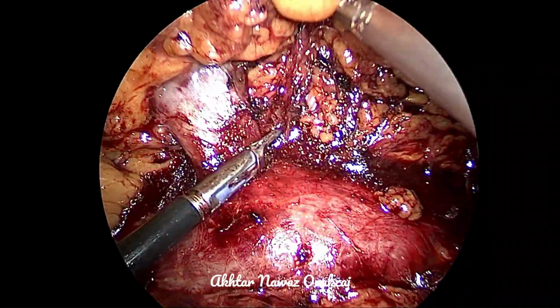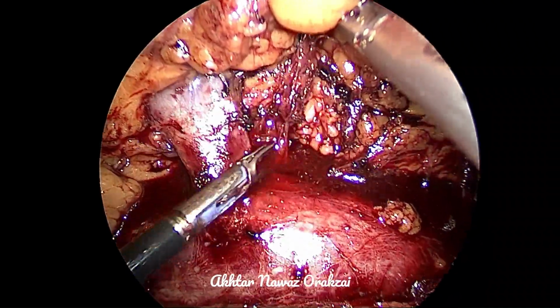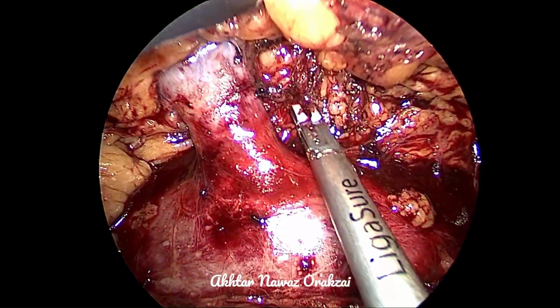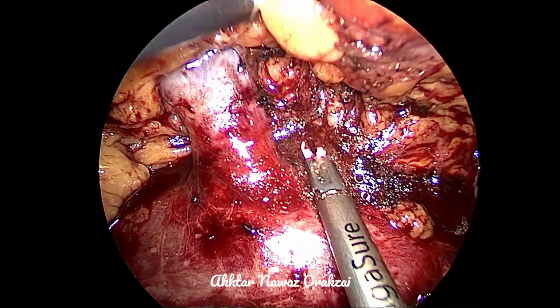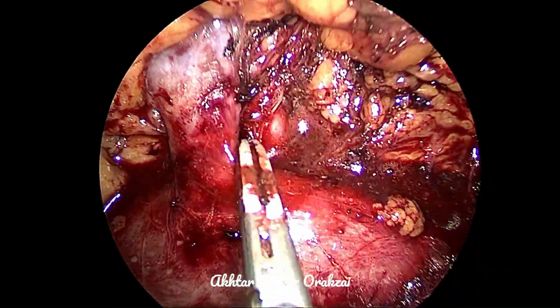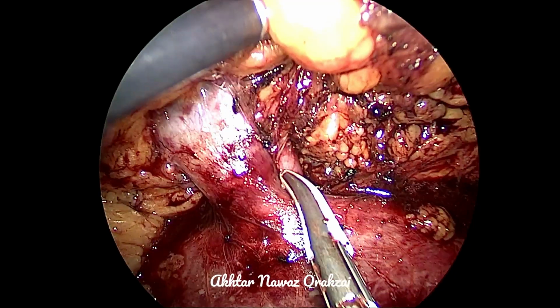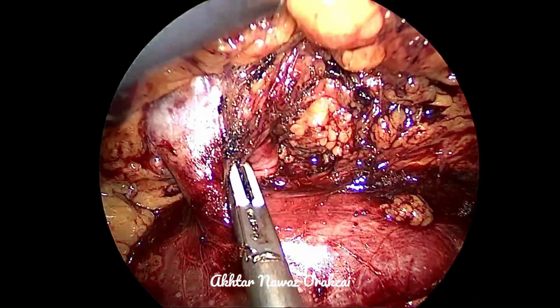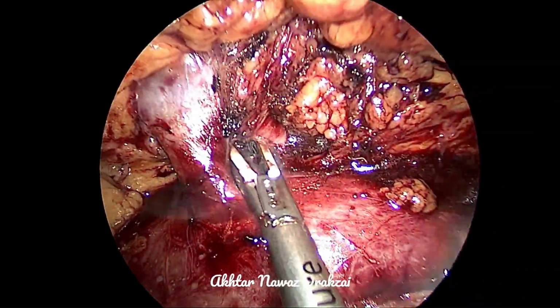So there are a few new things in this video. One was the adhesions of the colon to the liver, and the second thing is about to come, and then we will do some maneuvers in order to overcome those difficulties.